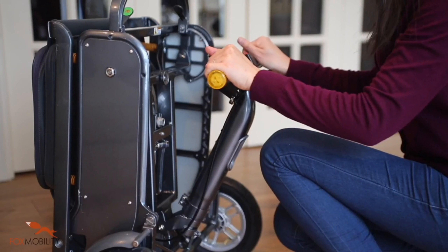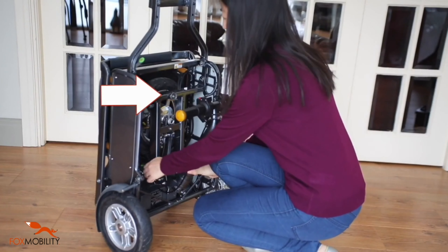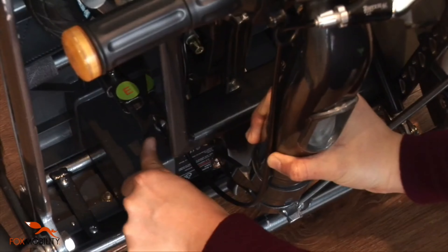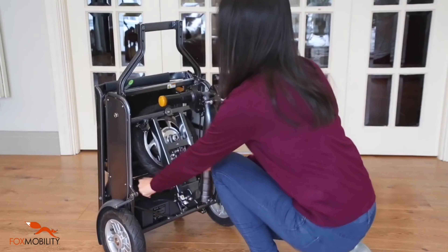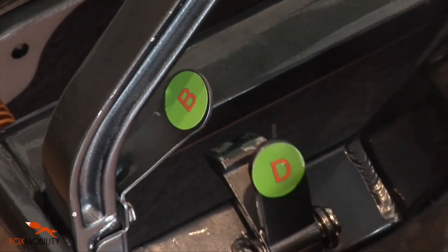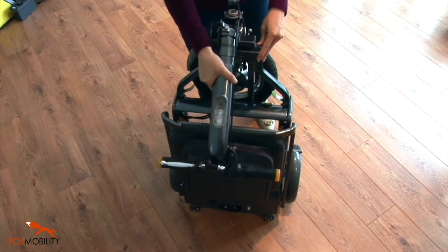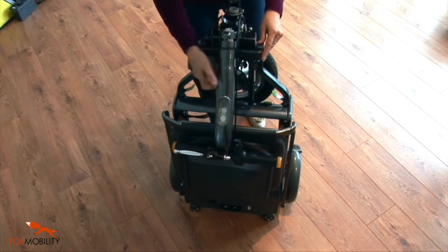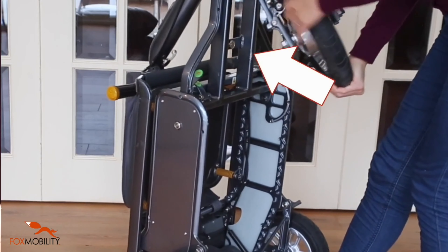Hold the handlebar assembly with both hands and release the magnetic lock. Use your left hand to release latch E. Raise the handlebar with the front subframe until latch D is properly engaged in its socket. The handlebar may now be rested against the front of the seat. Slightly twist the front wheel to disengage the magnetic lock from the mainframe.